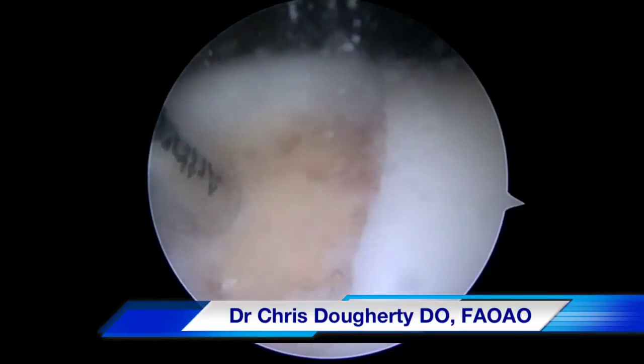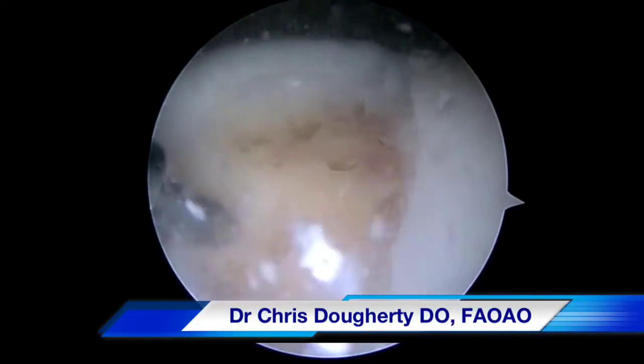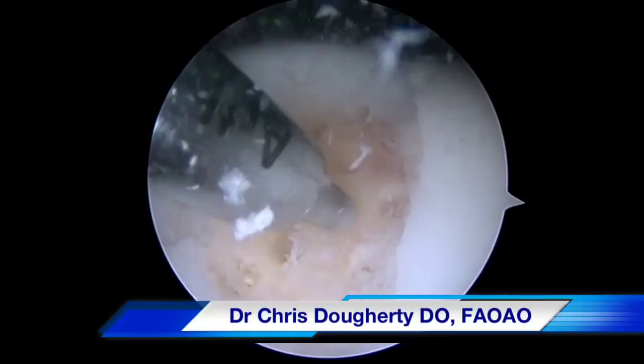We start by obtaining good vertical margins and performing a standard microfracture chondroplasty in the bed of the cartilage defect.